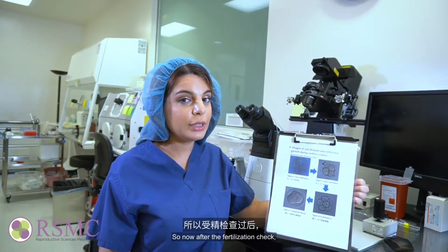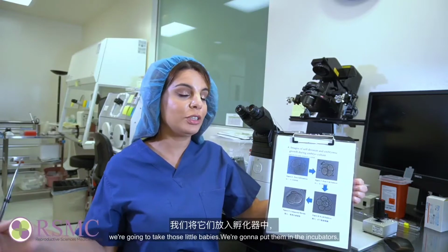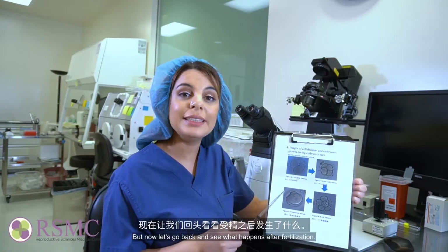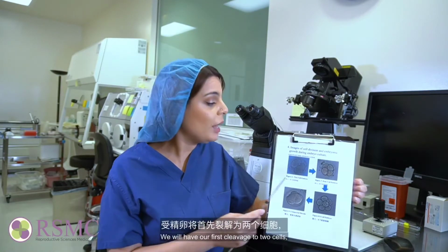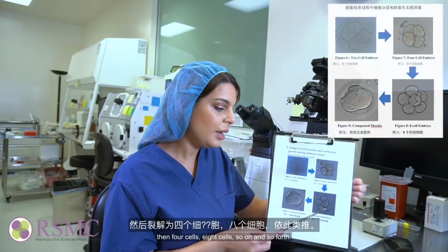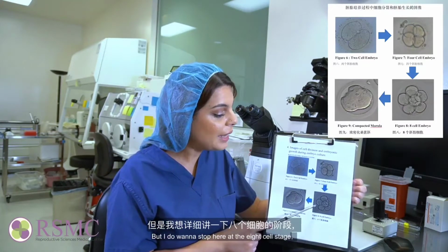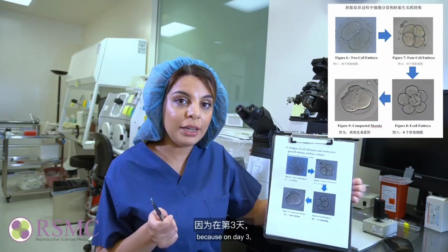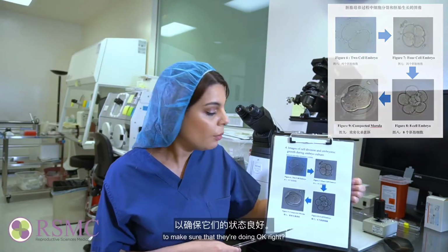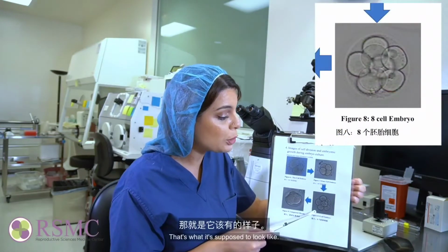Okay, so now after fertilization check, we're going to take those little babies, we're going to put them in the incubators. We're going to leave them there until day 3, then we will check. But now let's go back and see what happens after fertilization. We will have our first cleavage to 2 cells, then 4 cells, 8 cells, so on and so forth. But I do want to stop here at the 8 cell stage, because on day 3, we do check on our little embryos for grading to make sure that they're doing okay, right? So if you look at this 8 cell here, it's pretty beautiful.